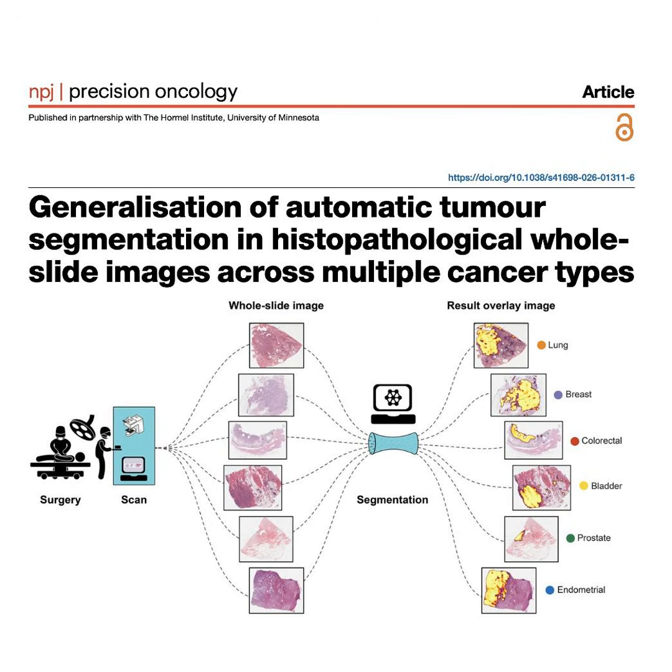Oh, yes. They ran this incredible experiment using the breast cancer dataset, comparing the AI's annotations directly against two expert human pathologists. We'll call them pathologist MP and pathologist LV. Okay. First, they established a baseline by testing intra-observer variability. Meaning how much a single doctor agrees with themselves over time.